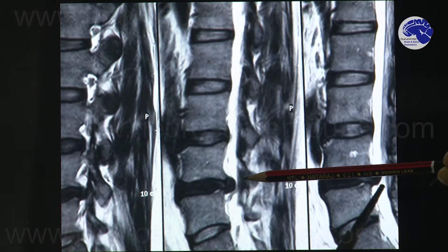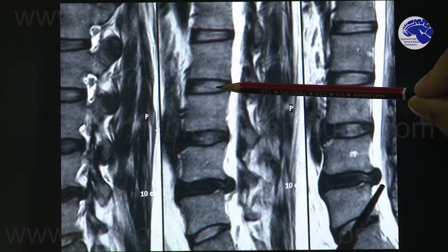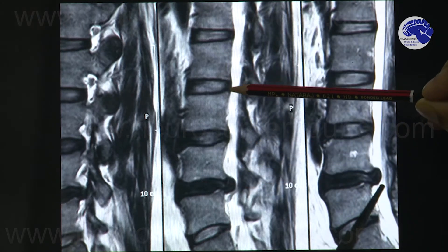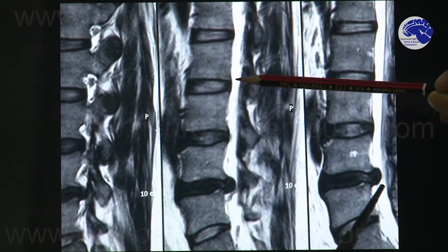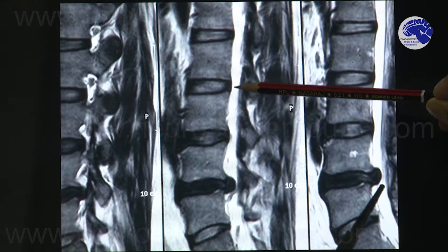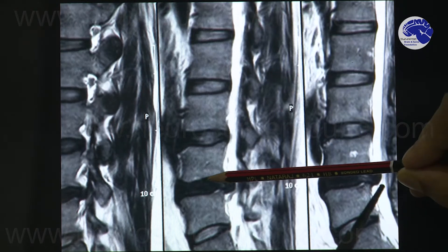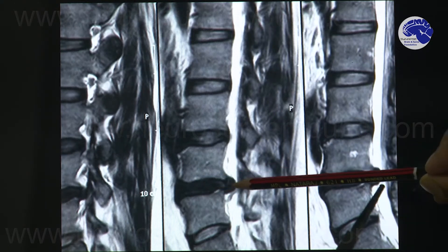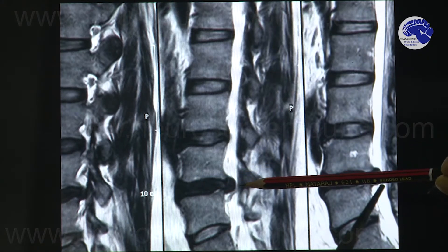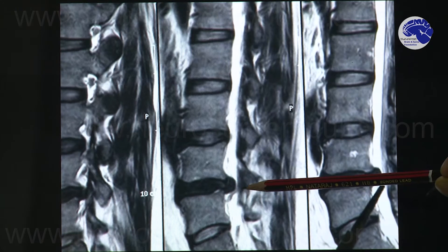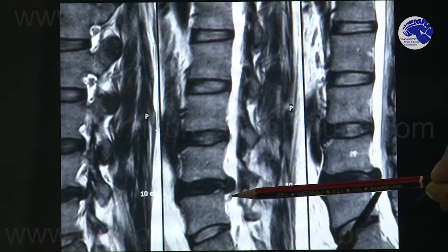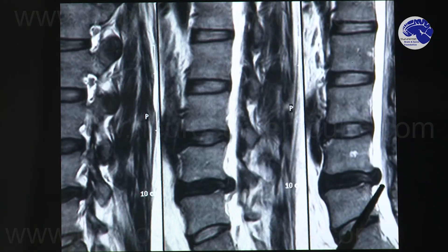If you look at this disc which is normal, you will see normal disc architecture with no prolapse or herniation. But here the central portion of the disc has slipped back and is literally rammed into the nerve that is going to his thigh, which is why he was getting this severe pain.